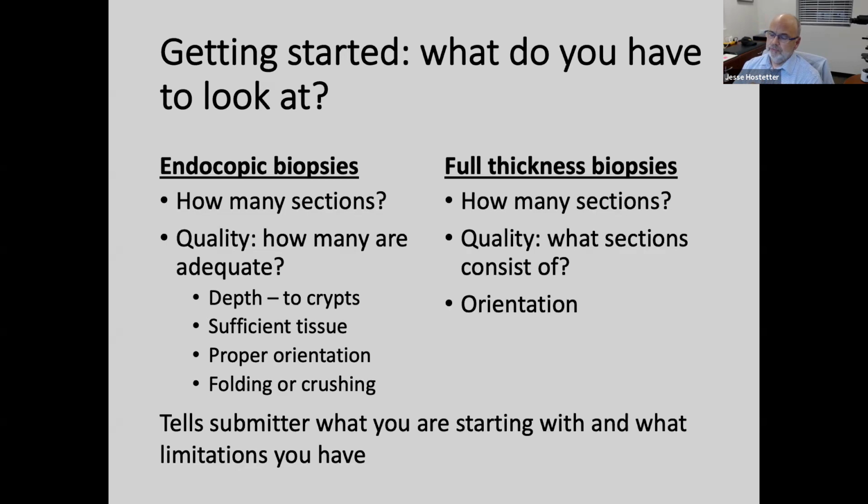Most of the time, if we think of full thickness biopsies, those are in pretty good shape and they're a little bit more straightforward. But I've got a couple examples of some problems that we occasionally see with those as well. But I put this into my report, this statement about the quality and the number, because it brings the clinician and myself closer together. They understand what I'm looking at. They understand the limitations that I have when I'm coming to a diagnosis or an interpretation.